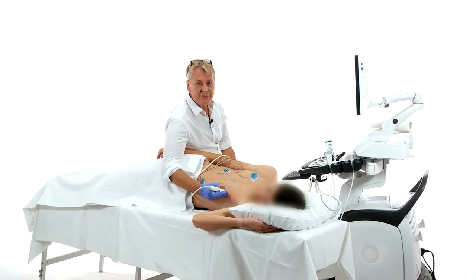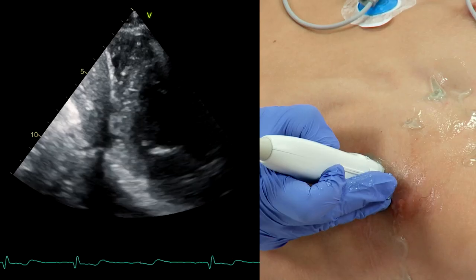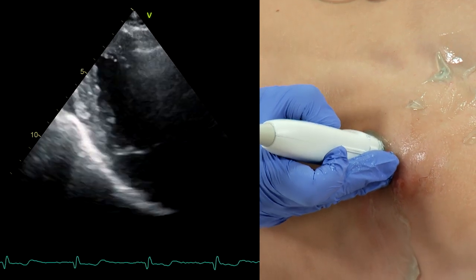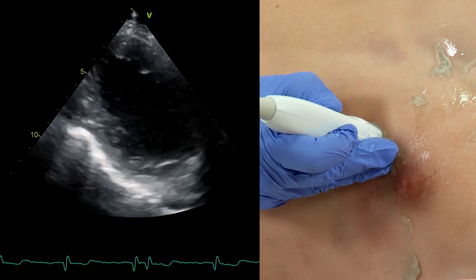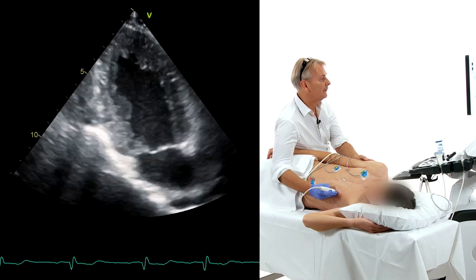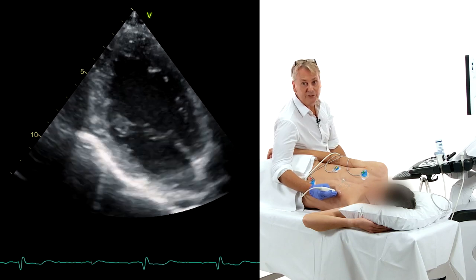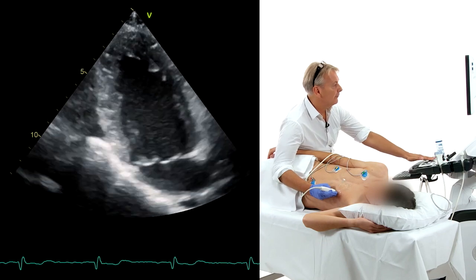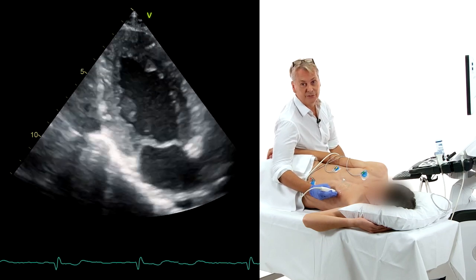There will be situations where it's actually better to ask the patient to inhale, especially in a two-chamber view. Let me demonstrate that. All of a sudden you will see a much better two-chamber view. Sometimes you will have to adapt the level of inspiration, but you can clearly appreciate that you have a better view of the anterior wall in this two-chamber view.